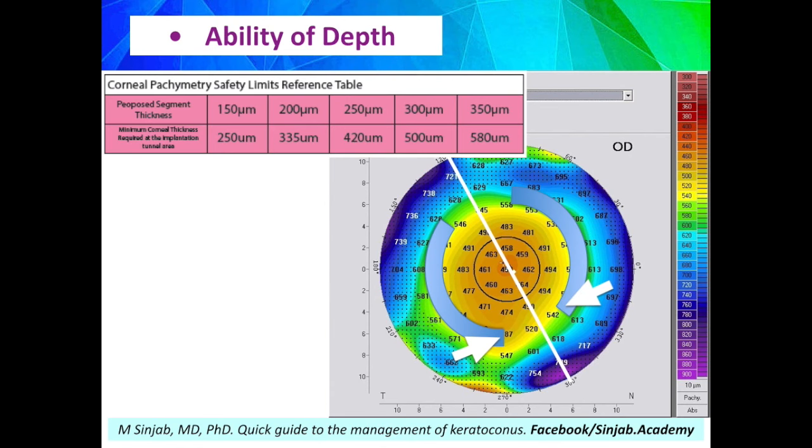And according to that, either I go straightforward with the measured segments, or if it is not applicable, either we reduce the thickness by 50 microns, and this will reduce the spherical correction, or if we are using the 5 millimeter, we convert into 6 millimeter type because they are implanted in a more peripheral part of the cornea, which is supposed to be thicker.